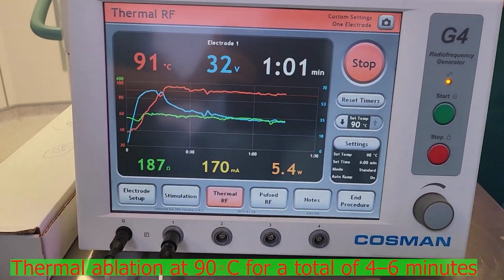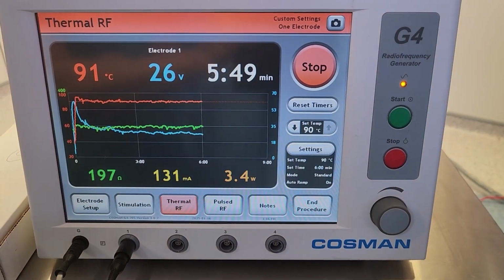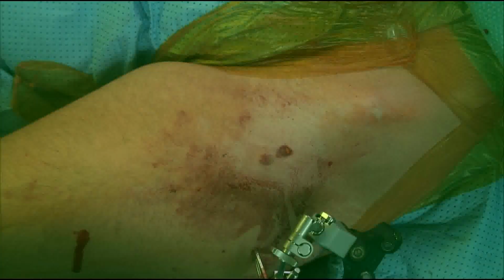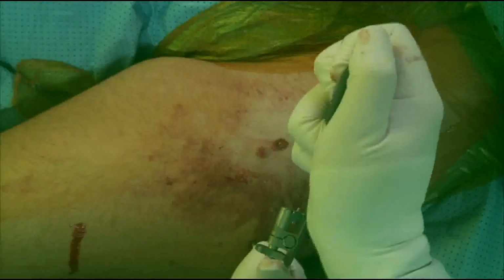Then when we finish the 5 or 6 minutes, we remove the electrode, we instill some local anesthesia in the joint, and we wash the area and we close it with absorbable sutures. Dressing will be applied as per normal.